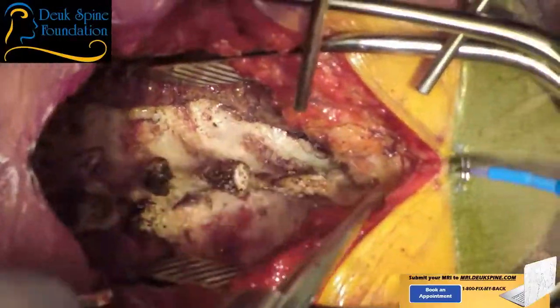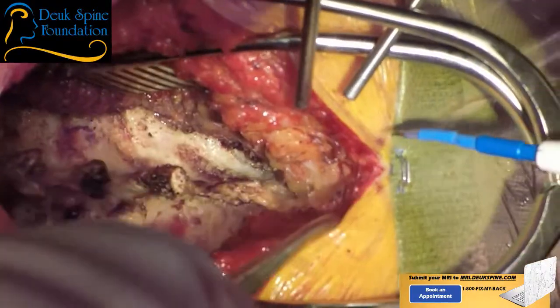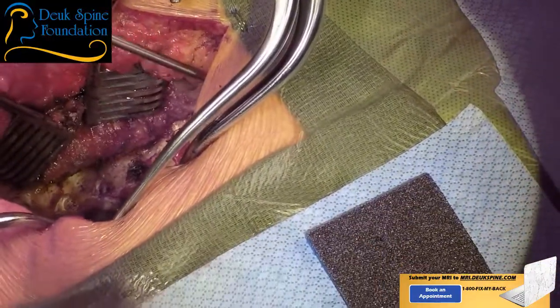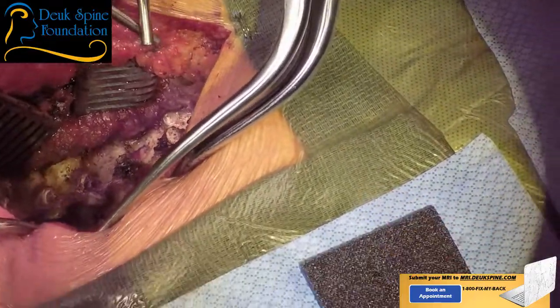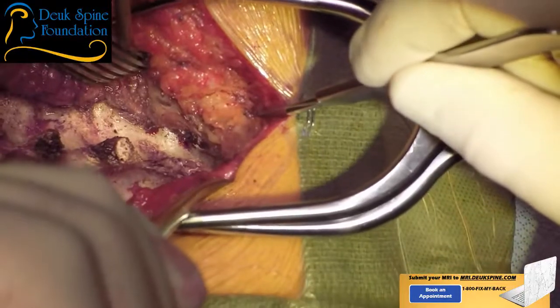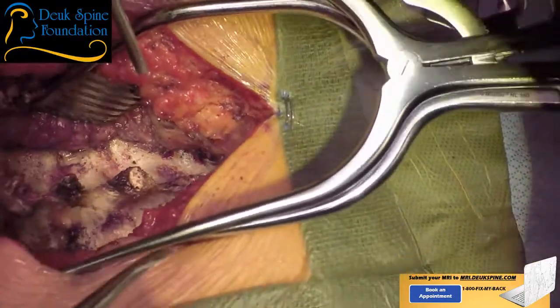If it is, then I'd recommend surgery on them. Okay? All right. So I feel pretty confident we're down to, let me have a skin knife. Just need a millimeter more. Isn't that what everybody says? Take that.